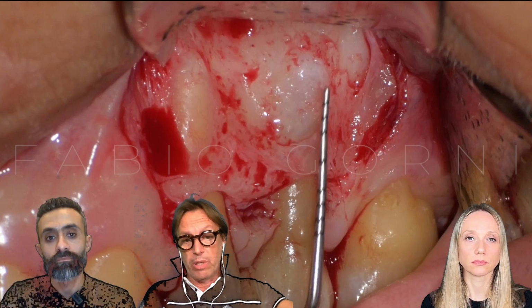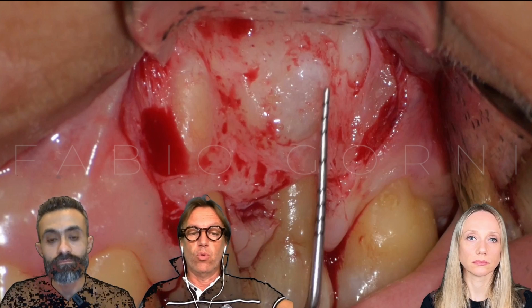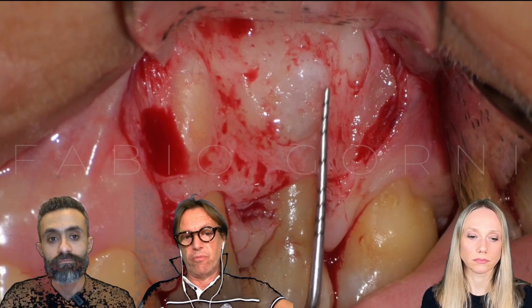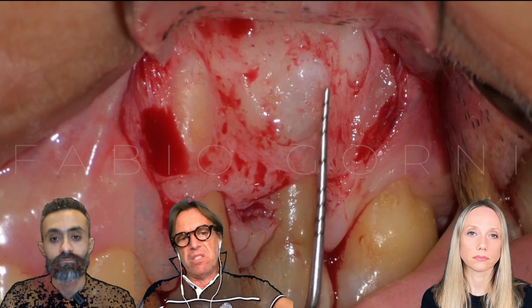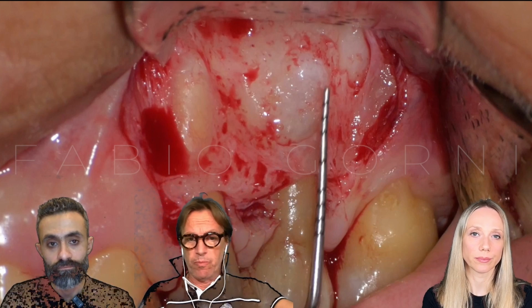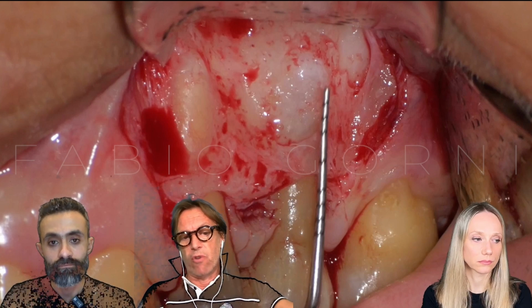When it's not so apical and close to the roots, we have to make an incision in advance, a couple of teeth if you want, and it's not so difficult to reflect the flap without any injuries to the mental foramen.